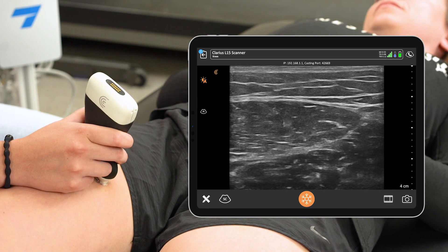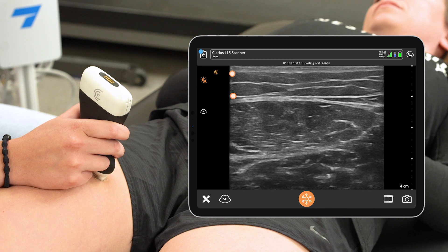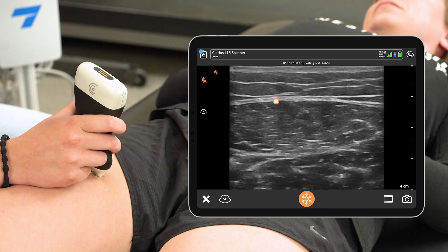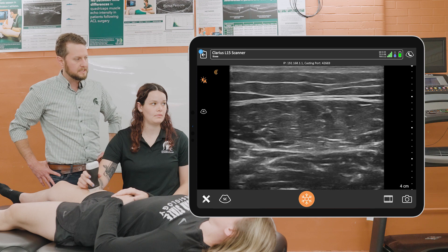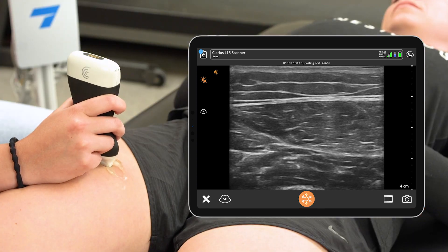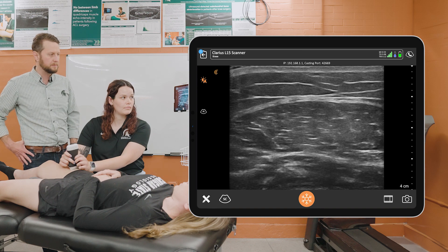What you can see here on the probe: we have the skin lying most superficial to the probe, then we have the subcutaneous fat lying underneath that skin, and then our rectus femoris muscle is the first muscle that we'll see on that image. When we're first putting the probe on, we'll move from medial to lateral to see the full extent of that muscle, and once we see both those edges, move the probe back to the middle portion to get a good midsection view of that quadriceps muscle.